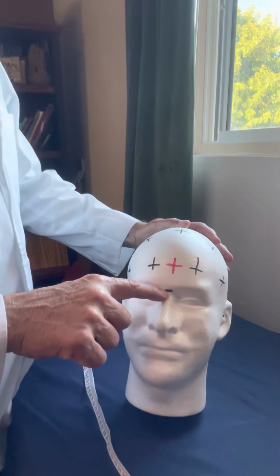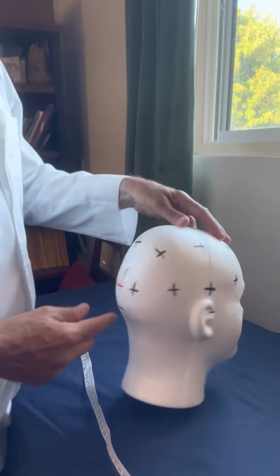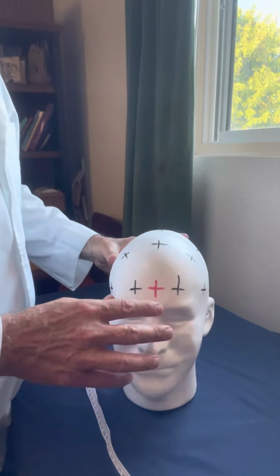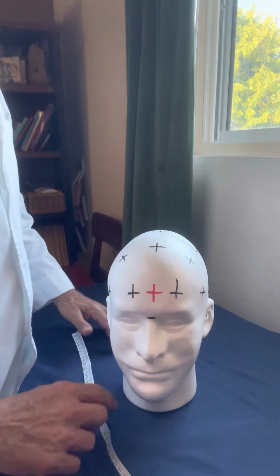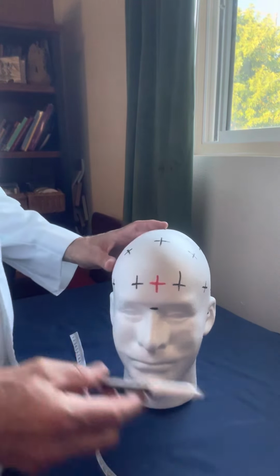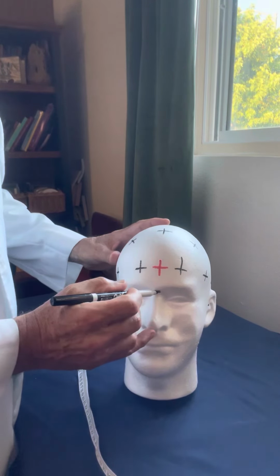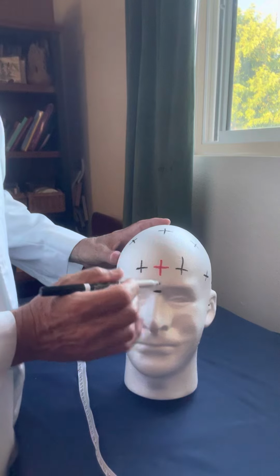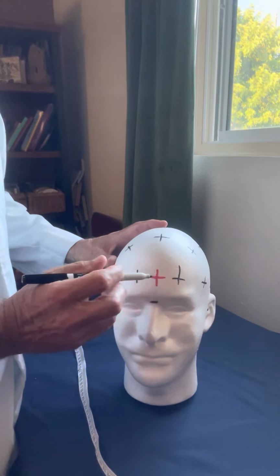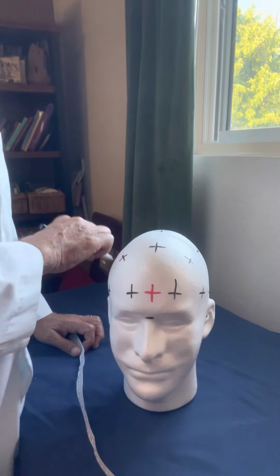So the nasion to inion distance on this mannequin that I measured for you earlier is 35 centimeters. So the distance from the nasion to FPZ is 10% of the nasion to inion distance.